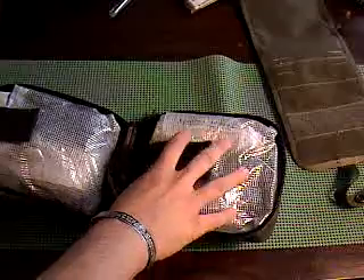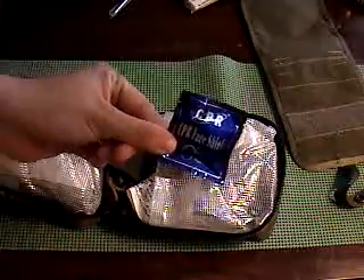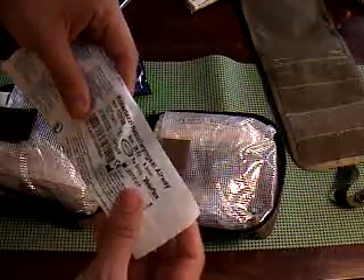This side is more trauma-related stuff and this side is more general-related stuff. I have some things mixed in, but that's just general. Opening up this one, I've got a CPR face shield. I have a nasopharyngeal airway — this is a 28 French, which is for most male adults.